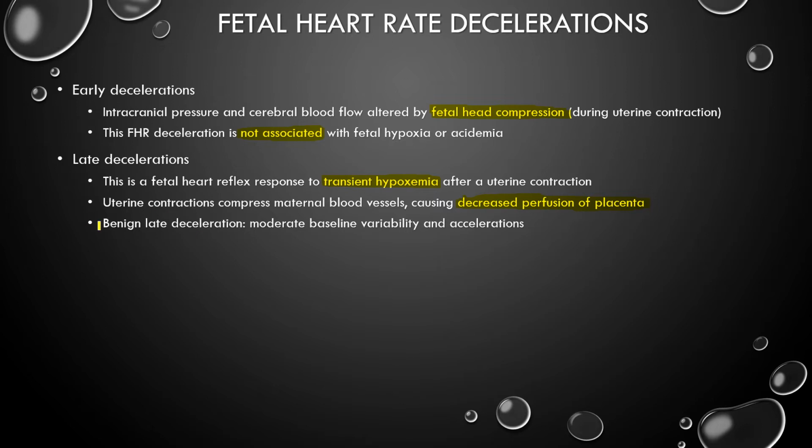So if you have a benign late deceleration, it will just happen very rarely, not very often, with moderate variability and with accelerations combined with it. So if it's a late deceleration that isn't problematic, you have very few late decelerations with good variability and accelerations.